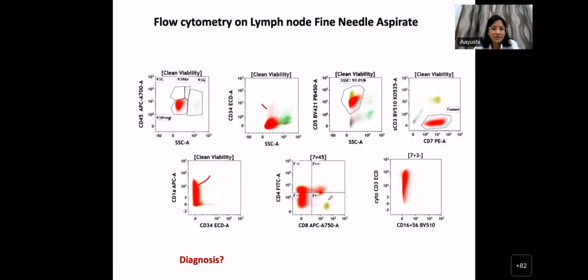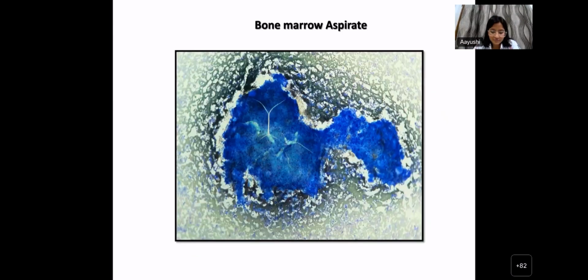Very good. Excellent. So we did a bone marrow. What do you think about the cellularity of this bone marrow, Ayushi? For a 32-year-old patient, it is somewhat a normocellular bone marrow. Are you sure? It looks to me that the bone marrow is almost packed. I can't see too much fat space. Okay, I would call it hypercellular. Yes, it looks like a hypercellular bone marrow.